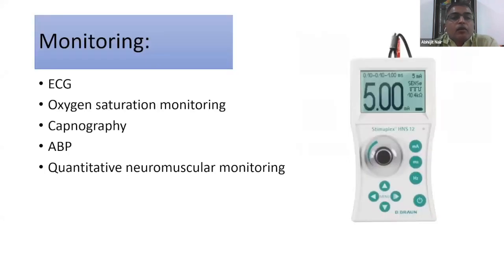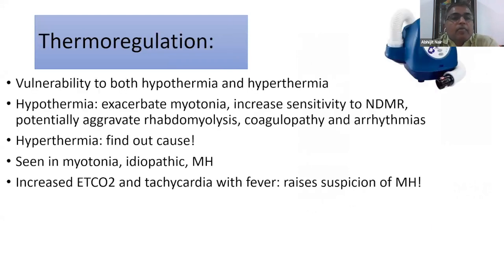Monitoring intraoperatively should be meticulous. Of course, the regular ECG, oxygen saturation, capnography, and an arterial line, if necessary. But as Dr. Poorna mentioned in his presentation, quantitative neuromuscular monitoring is mandatory if you are using neuromuscular blocking drugs in these particular patients.